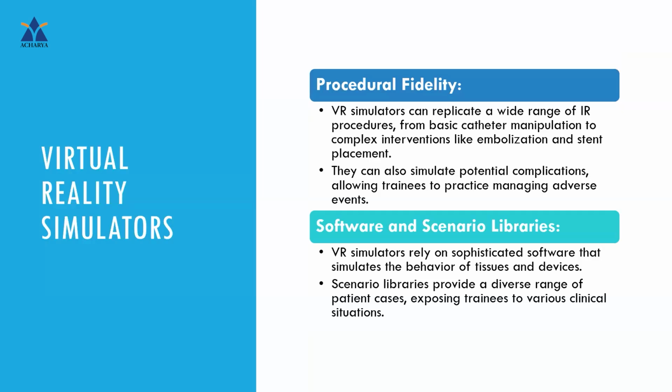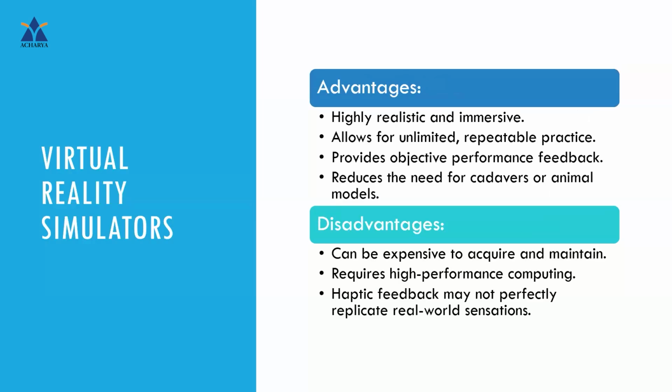So going back to virtual reality simulators, we have software and scenario libraries. Basically, you'll have a wide variety of options to practice what kind of procedure you can do. VR simulators rely on sophisticated software that simulates the behavior of tissues and devices. And we have scenario libraries that provide a diverse range of patient cases, exposing the trainees to various situations. So it is basically like a gaming setup. You'll have different levels or options, so you can select one of the scenarios and then practice how to do that procedure.